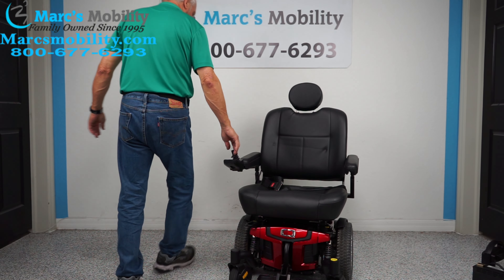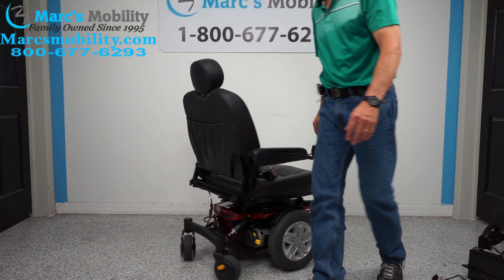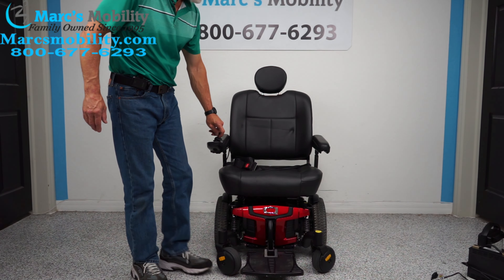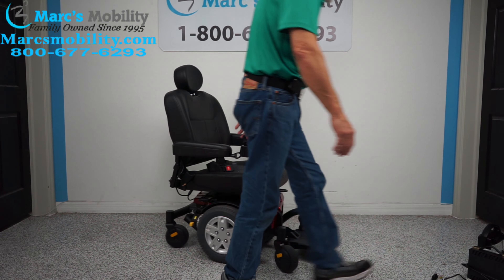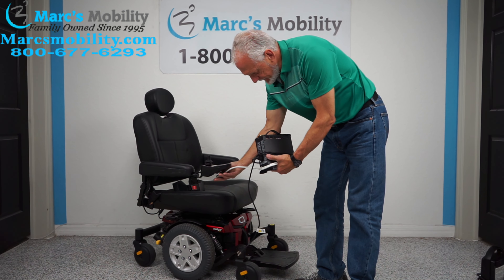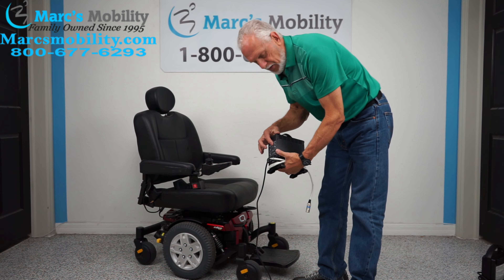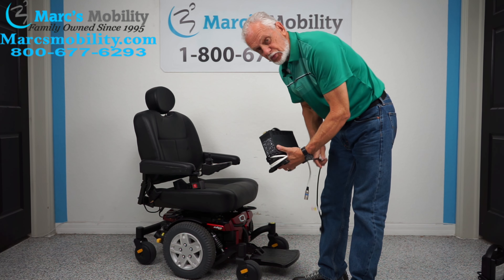This is a mid-wheel drive so it turns on its own length, as you can see. When you charge the batteries in this chair, you'll take your Quantum charger, plug it right here, and as soon as the light turns from orange to green, the charger will stop charging.